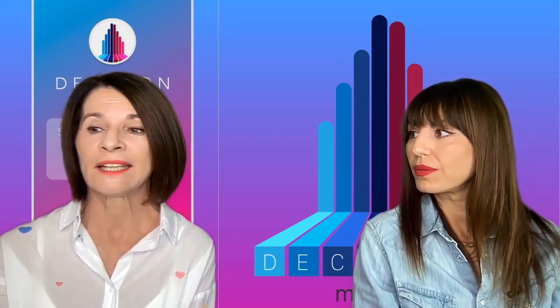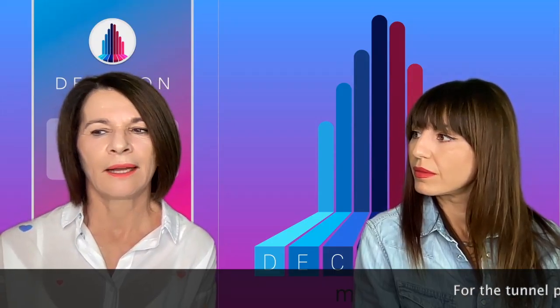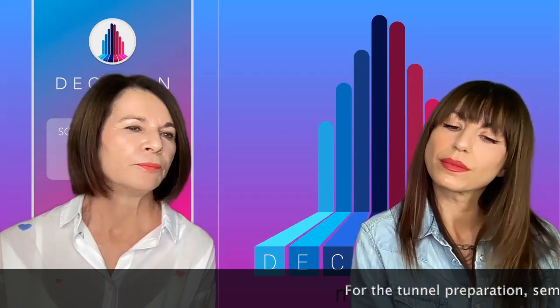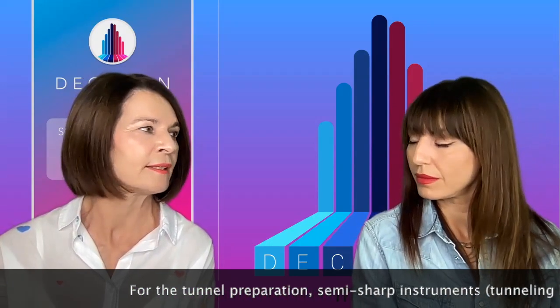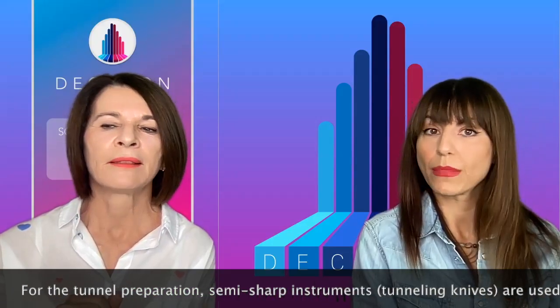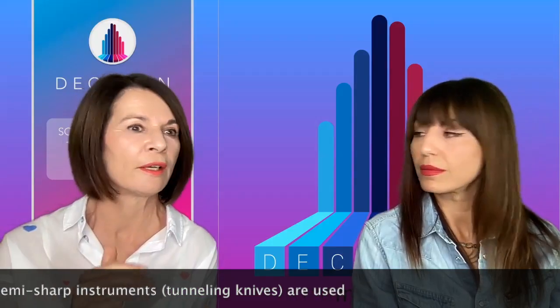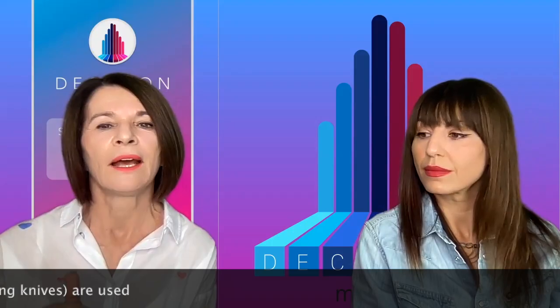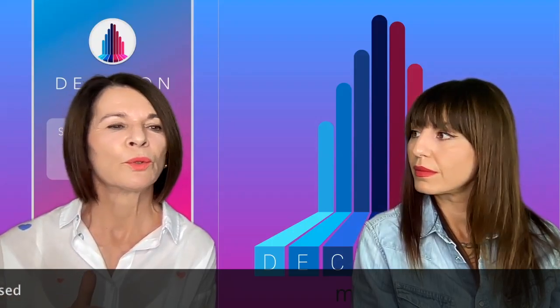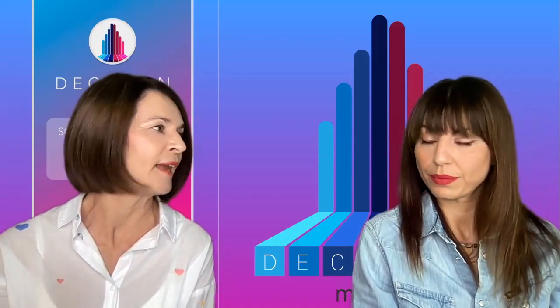The tunneling technique causes more swelling, and I would say it is because we first prepare our flap sharp with the blade coming from the sulcus, but then, especially in the area of the mucogingival junction, especially if there are some scars from a previous apicoectomy, we need to go to the semi-sharp instruments, tunneling knives.